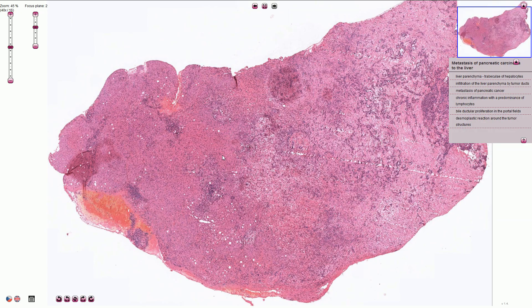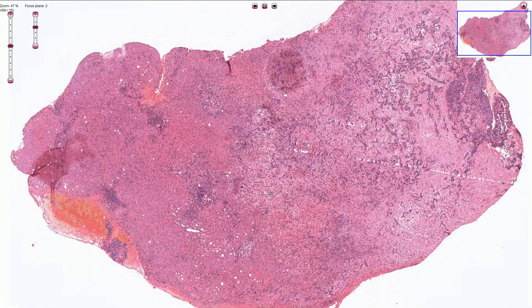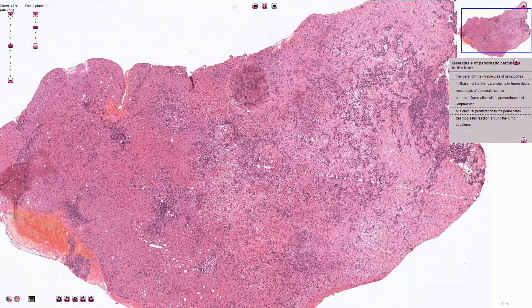Here we have normal liver parenchyma with some mild chronic inflammation and mild steatosis, and here we see the mass of the tumor.